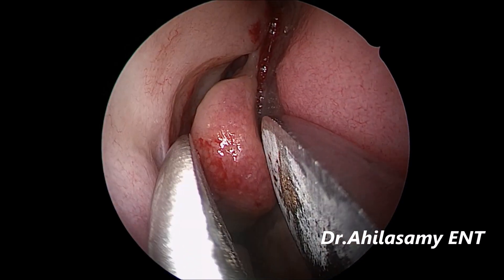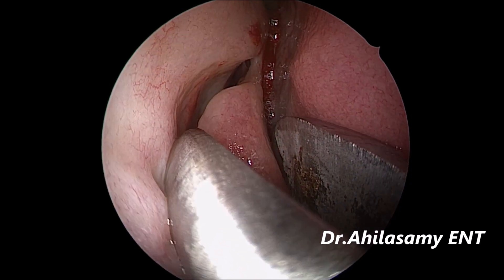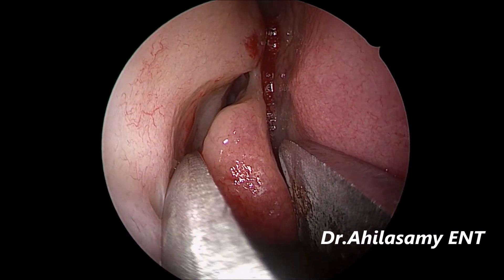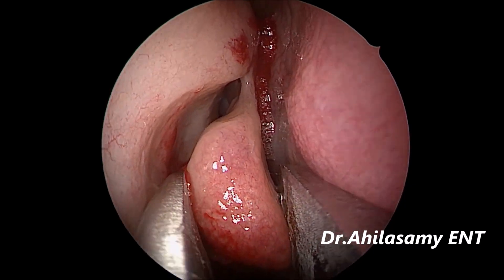This is Dr. Ahila's concha crusher which I have devised. It is available with Sandosa, Mumbai, which I am using to crush the concha bullosa.